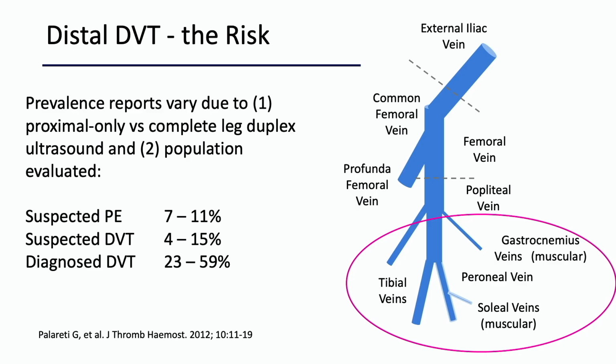In your labs, are you routinely doing complete leg ultrasounds? Yeah? Most of you? Anybody doing proximal only? Out of curiosity? I can tell you in our center it varies by the location. So some of the labs at Sinai will do proximal only. Our lab will do complete leg. But I think it's really important to know.